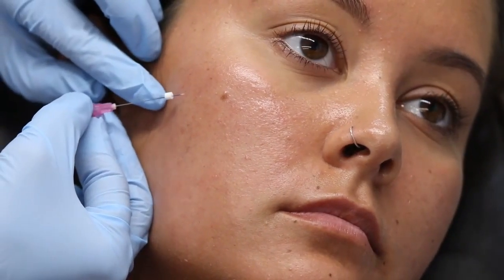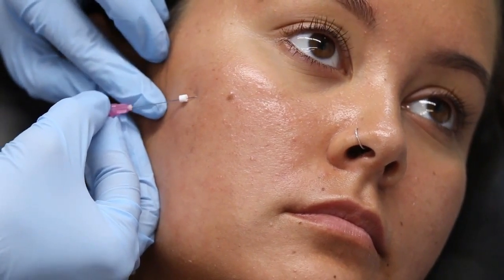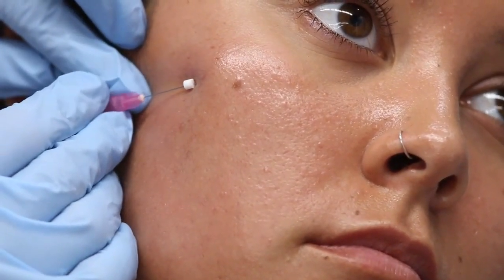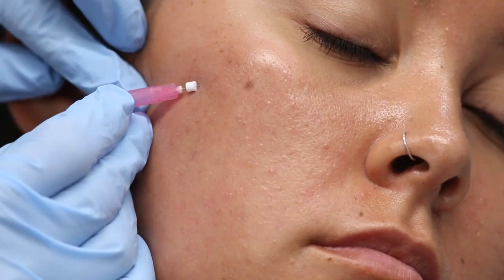This is all about great technique, which you're going to see Ashley accomplish here, and that's what makes it a fairly comfortable procedure. Patient may feel a little bit here and there, and Nicole knows what to expect at this point too. So Ashley, whenever you want to jump in, we'll let you jump in here too. She is using, I think, a 29 gauge by 30 millimeter thread, and just going to place it in there.